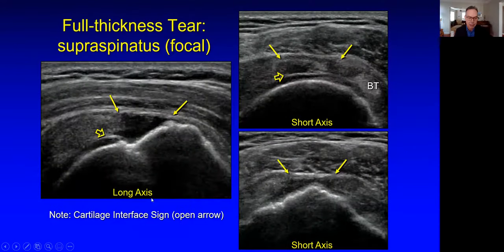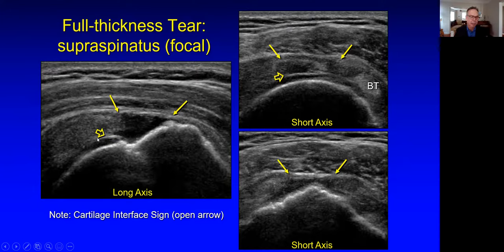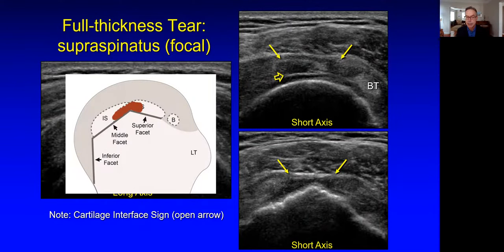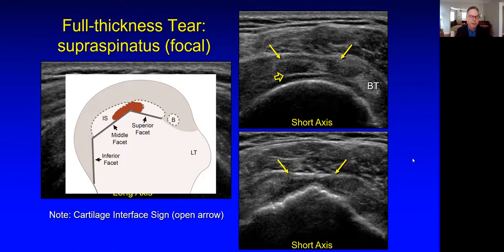Here's a full thickness tear — this one is easier to see because it's filled with fluid. The defect goes from the bursal surface to the articular surface. This is the cartilage interface sign: the normal bright line will be brighter than normal when fluid is touching the hyaline cartilage, telling us indeed this tear goes to the articular surface. Note the cortical irregularity. In short axis we can see the width of this tendon tear, but some tendon fibers are still seen anteriorly. Therefore this is a full thickness tear of the supraspinatus going from the articular to bursal surface, but it's focal — not full width because there's still some supraspinatus present anteriorly, although with tendinosis.